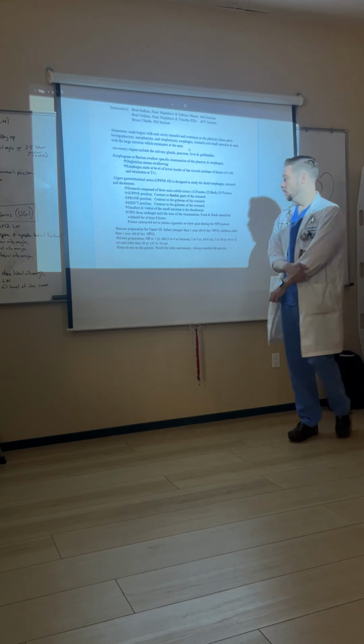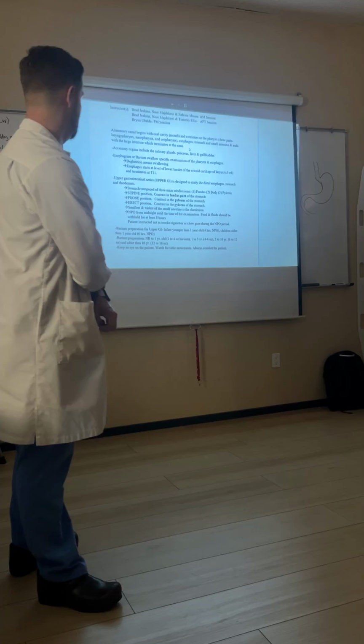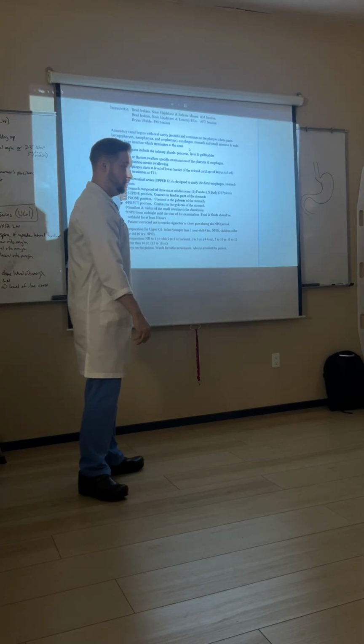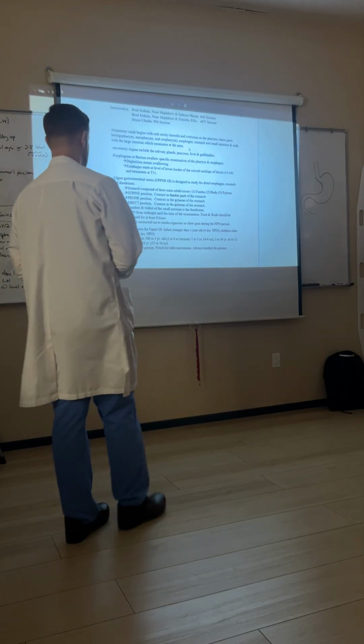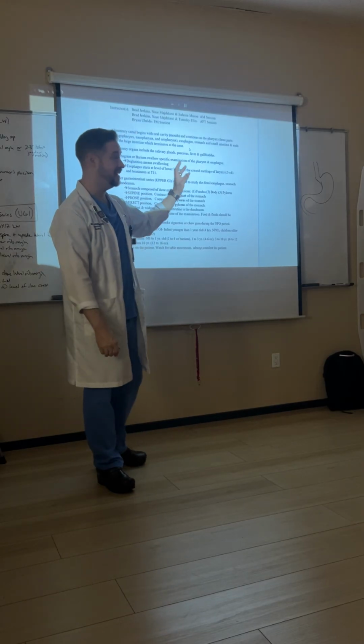Okay. What we're also going to need to know about fluoroscopic imaging of the GI tract is what position of the patient places the barium in what part of the stomach, okay? So if the patient is lying on their back, the contrast media is going to collect in the fundus.